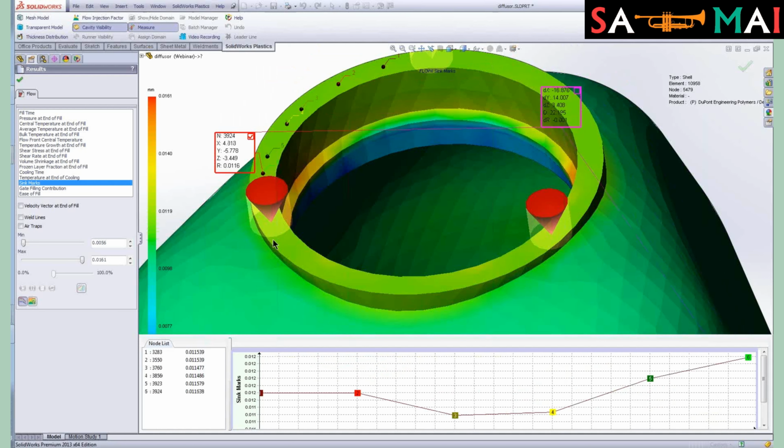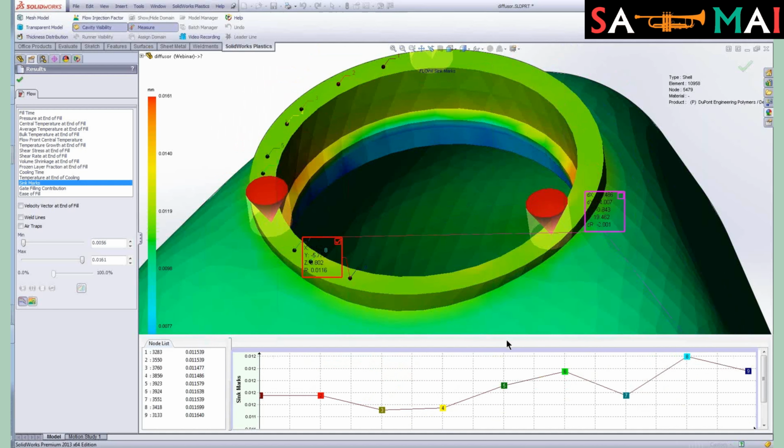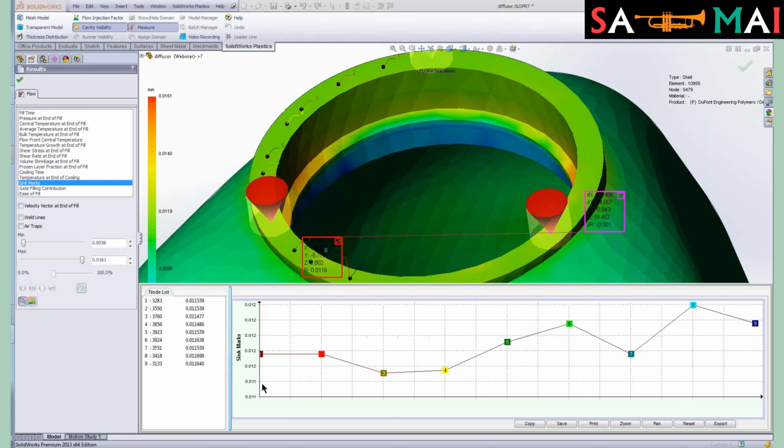And what this allows us to do would be get an idea of how much sink around this part might affect us. So if I make this a little bit larger, we can see that we're ranging from somewhere right around 12 thousandths of an inch to not much higher than that. And then on the node list, we get all this data here. This gives us an indication of what the flatness of that part might be.